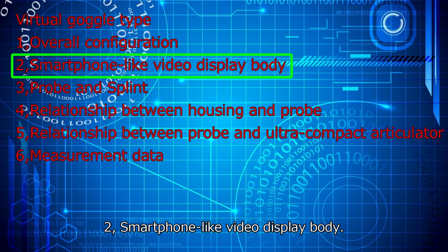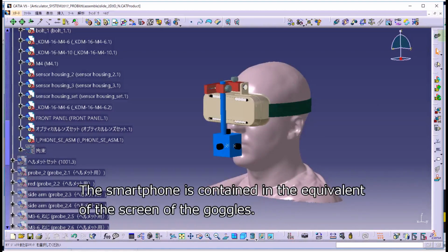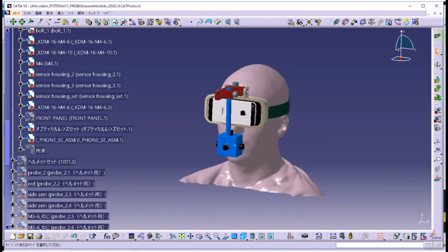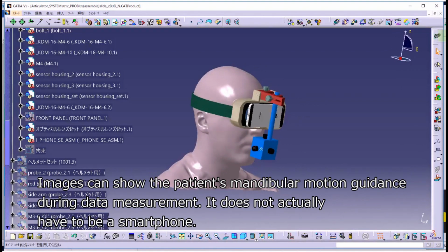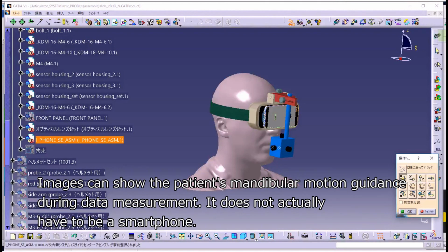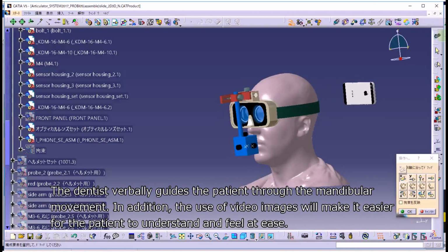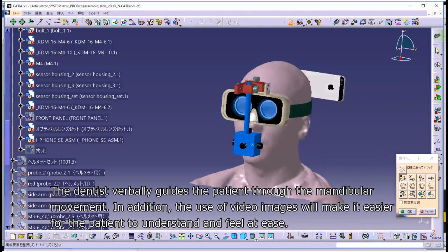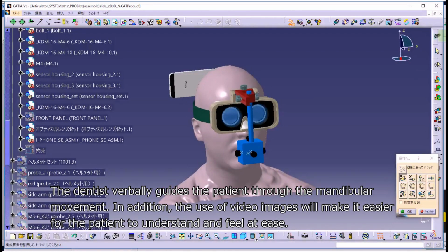2. Smartphone-like video display body. Hide the goggle cover. The smartphone is contained in the equivalent of the screen of the goggles. Images can show the patient's mandibular motion guidance during data measurement. It does not actually have to be a smartphone. The dentist verbally guides the patient through the mandibular movement. In addition, the use of video images will make it easier for the patient to understand and feel at ease.